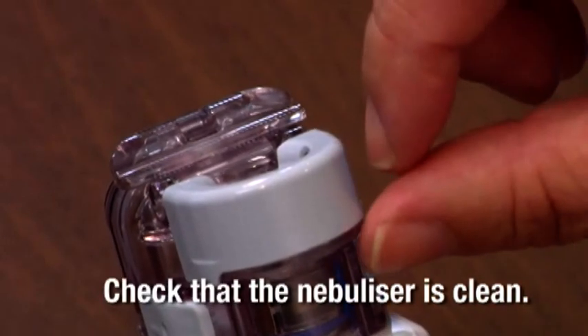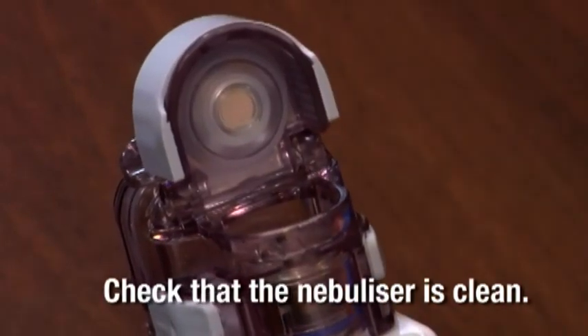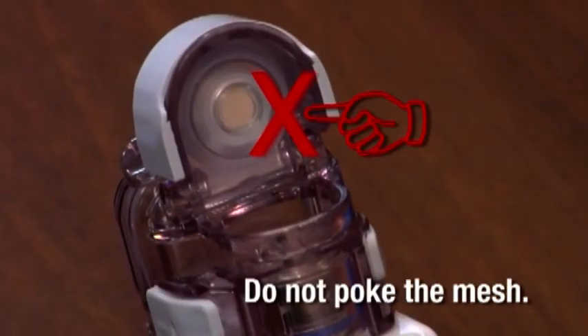Also, check that the nebulizer is clean. Do not poke the mesh — this is the most sensitive part of the nebulizer. Its cleaning will be detailed later in this DVD.